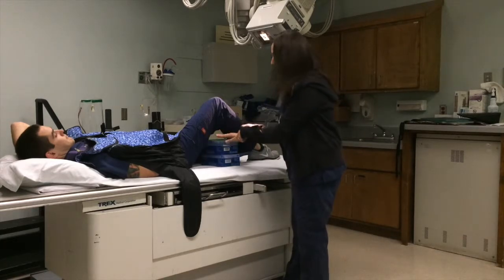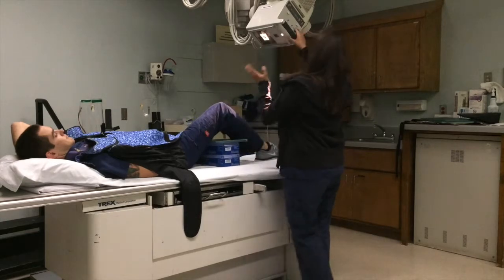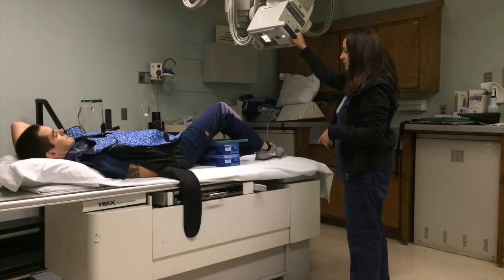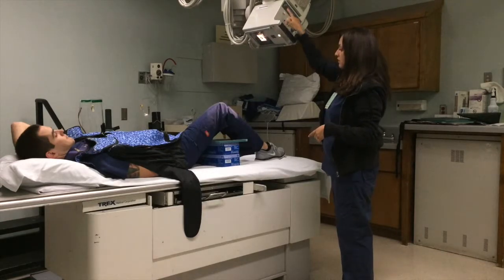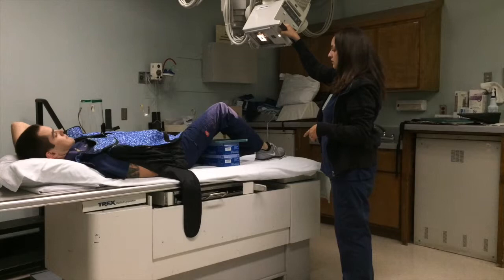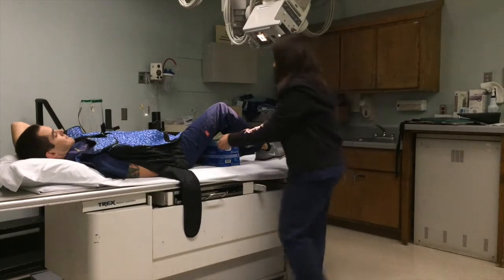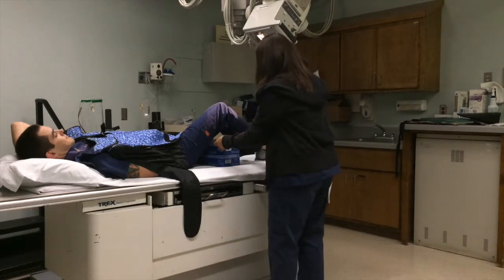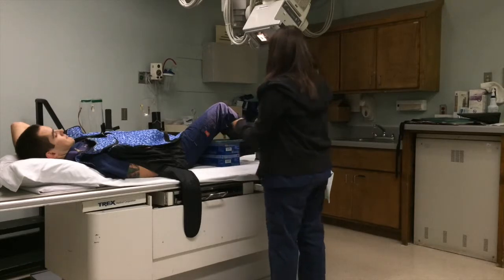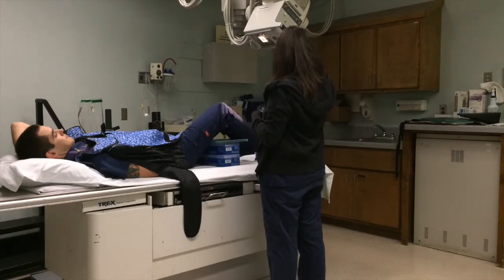This could be a problem because I'm going to be shooting off the film, so I might drop his leg just a little bit. That looks good. And then that means I'm going to drop my ankle just a little bit. It's important to take your time and get exactly what you need. All right, so now I look. There's my line, so that looks good. Get him onto the film. Make sure that he's on the film. Super perfectionist.